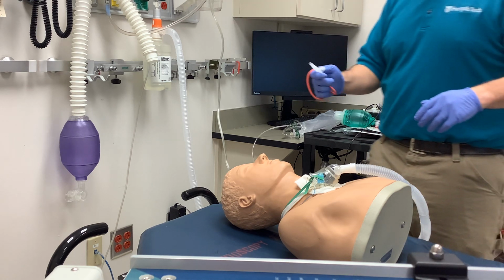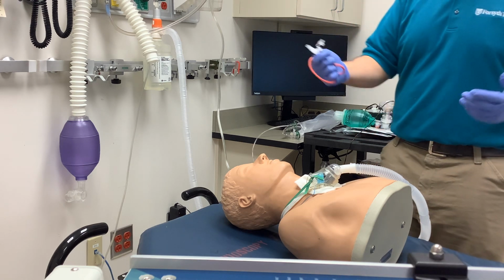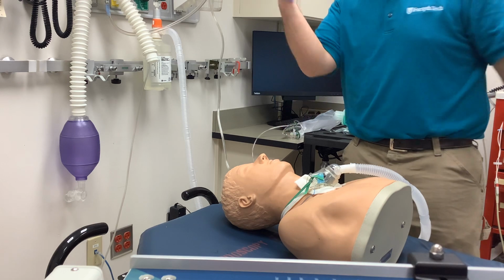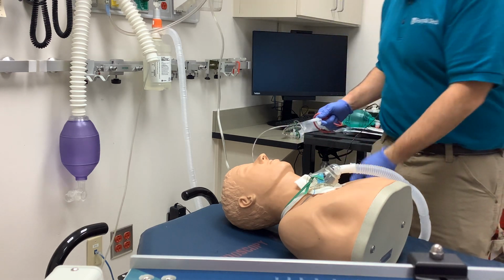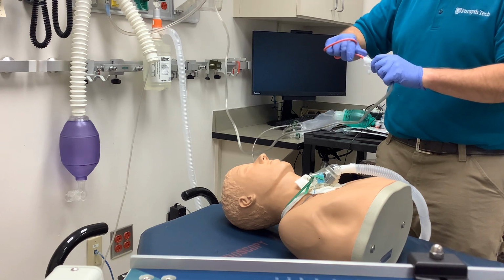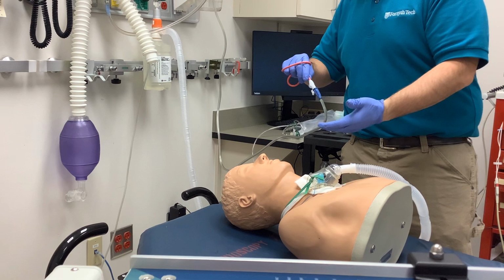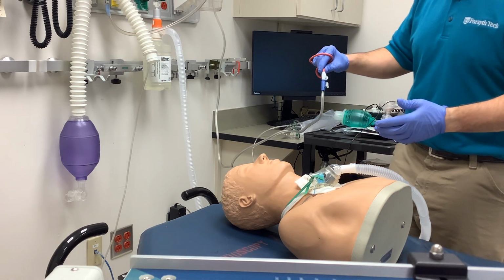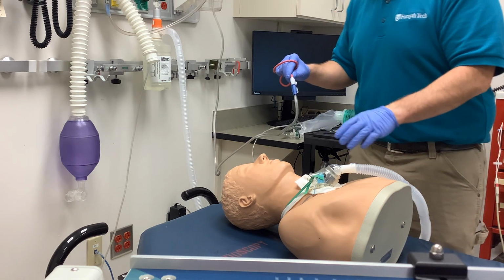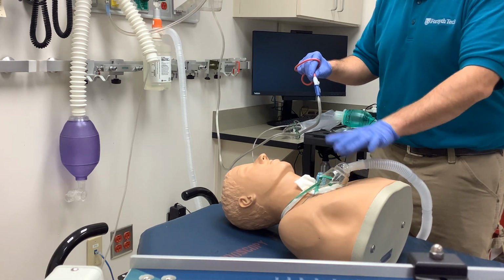And then when it comes time, so I've got this wrapped up, you would still utilize your sterile procedure with this. You've got your sterile gloves on, so I can utilize my sterile hand and my clean hand to go ahead and attach my suction catheter. Again, if you needed to dip it in water, what have you, you can. When you're ready to make suction, let them know. I'm going to go ahead and go down your tracheostomy tube with a suction catheter. I'm going to clean that out. So you can take this and slide it out of the way, this being the tracheostomy tube collar.